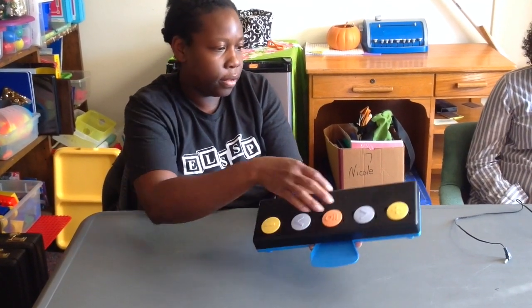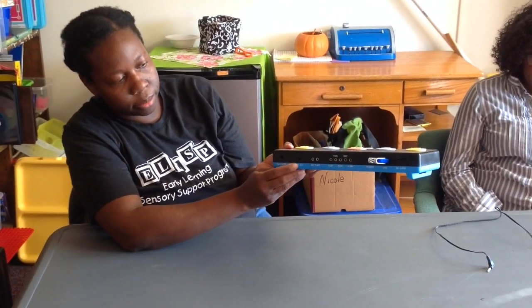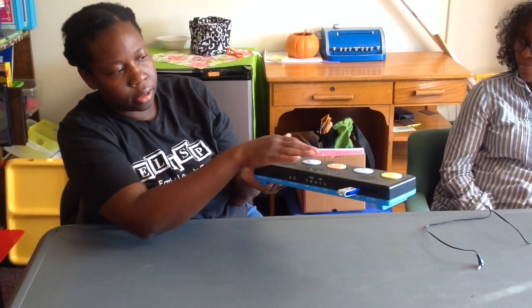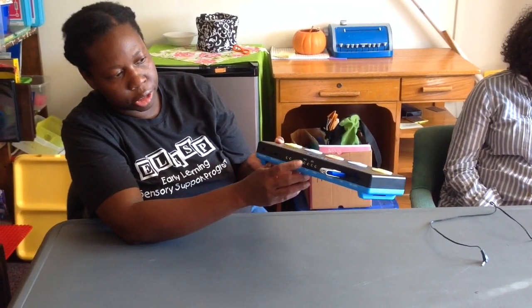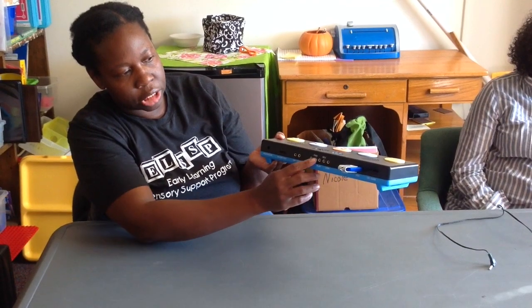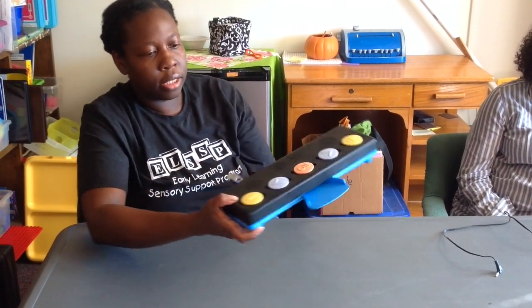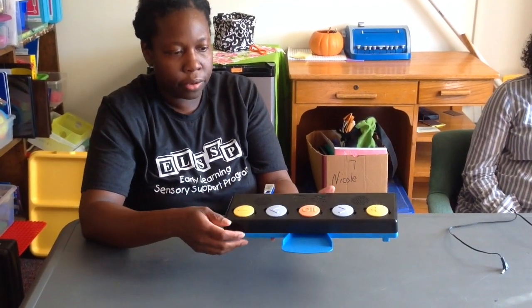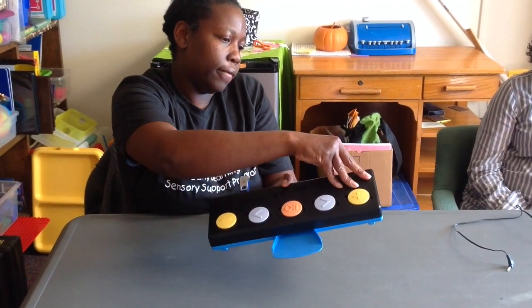Let me turn it around. You have your on, your off button, and then you have it where you can put the switch in it, so you just kind of turn it and then you can put your switch into either slot that you want to teach the kid. If you're using a switch, you don't have to though. And then it's just very simple to use. You have your on button. I have it on the switch, sorry.